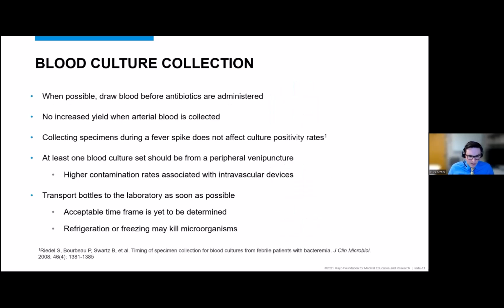Okay, and so this collection process, we end up getting quite a few questions surrounding this collection process, and I tried to summarize some key points here that I wanted to go over and highlight. One of the common questions that we get, and I highlighted some data as I talked about sepsis and the need for prompt treatment, is we get questions about drawing blood before and after antibiotic administration.